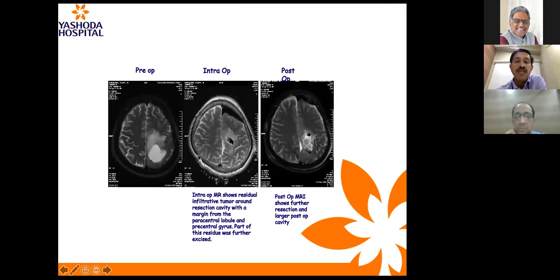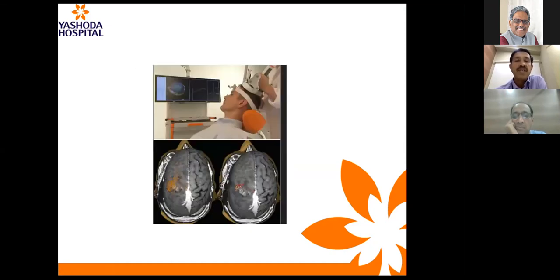When we did subcortical stimulation, we did intraop MRI. We had some more tumor that was left, which could be resected. The patient, meanwhile, had developed a deficit, thankfully improved by the time we completed the intraop MRI. That means it was not a permanent damage, it was only a mechanical distortion induced dysfunction. We could confidently go ahead and resect that extra piece of tumor, and we could establish a diagnosis of grade 3 glioma in this patient without giving him an additional deficit, which made this patient go directly for radiation and preserve his functional integrity.